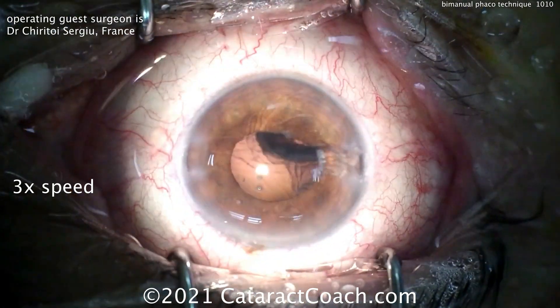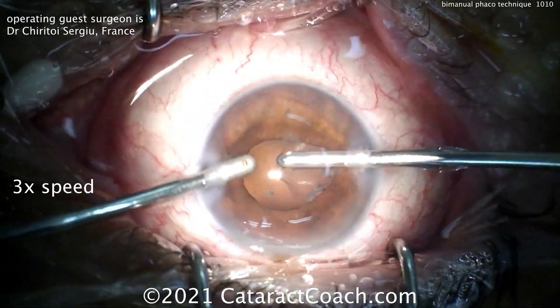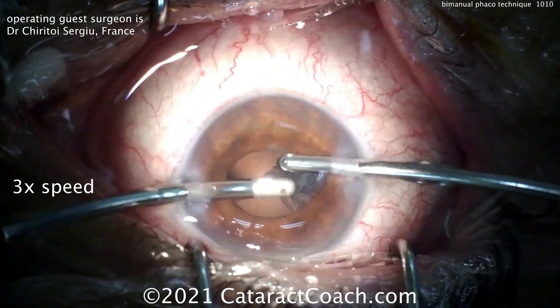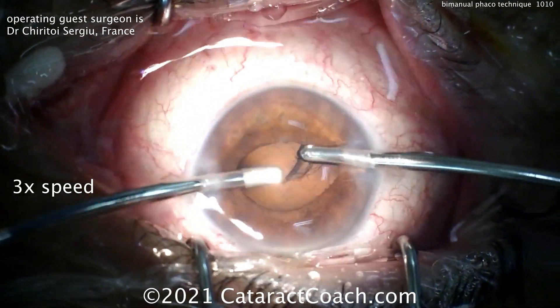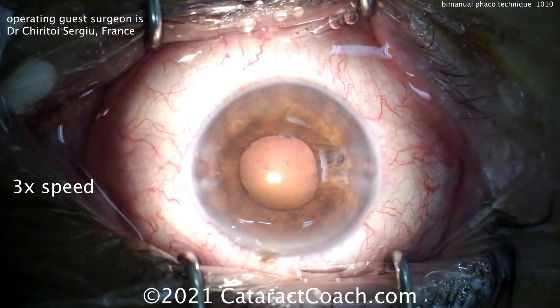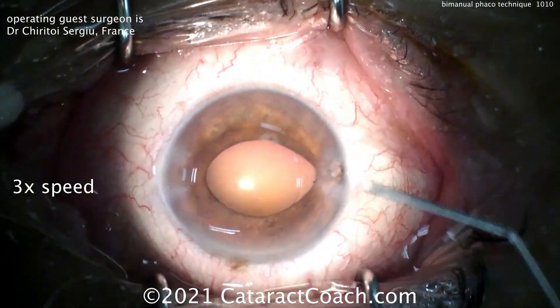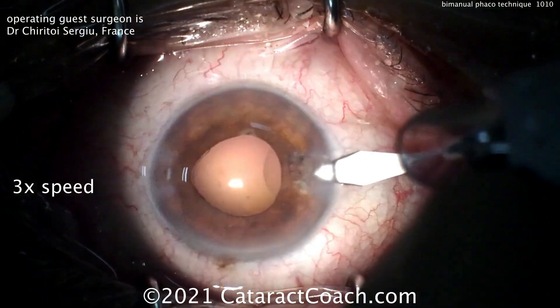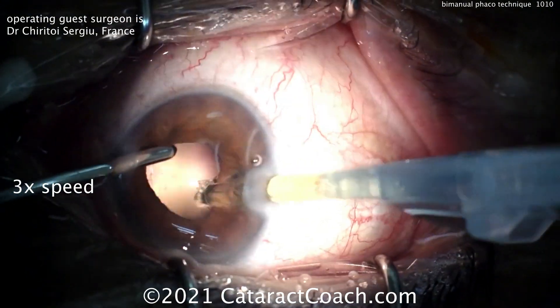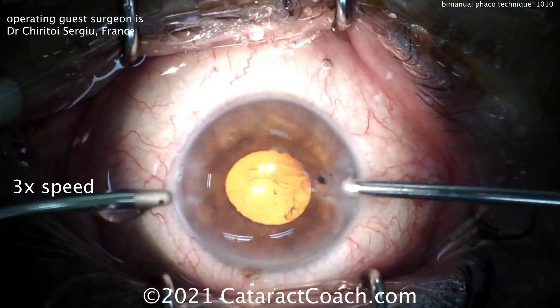With the smaller incisions, you may have limited choices in terms of IOLs. Most surgeons use IOLs that go through incisions of somewhere around 2.5 to 2.8 millimeters wide. You can put those same lenses through slightly smaller incisions if you use a wound-assist technique. There are a couple of lenses available that go through even tinier incisions of around 2 millimeters, but those are not as commonly used. The incision was enlarged here — which begs the question: if you're going to enlarge the incision anyway, why not just do coaxial FACO? Then you can use any second instrument you want because the infusion is paired with the coaxial FACO probe.